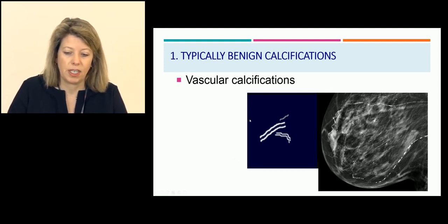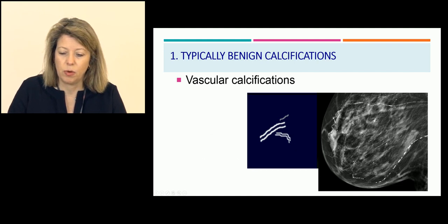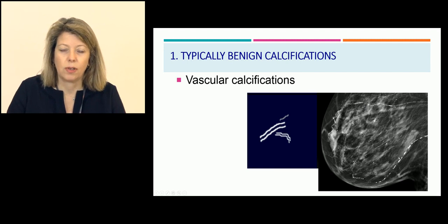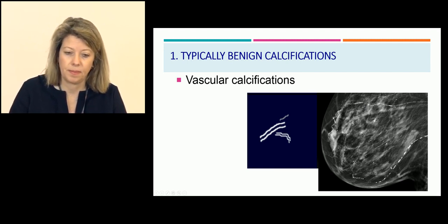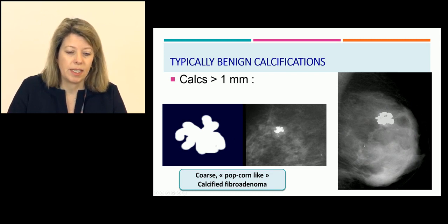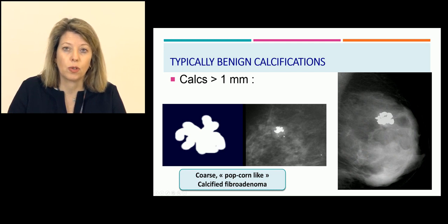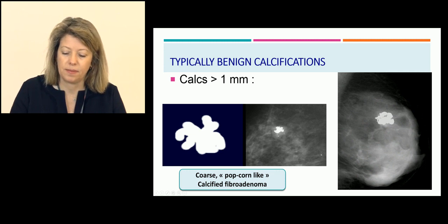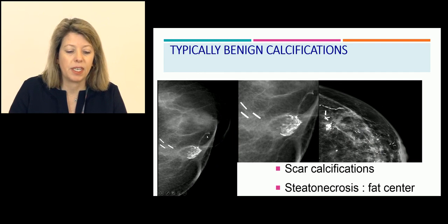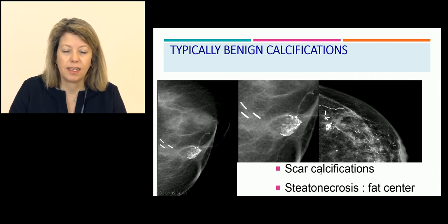These are vascular calcifications — as you can see in this mammography with typically benign vascular calcifications. These patients have diabetes and it could be a marker of arteriosclerosis. Another case of typically benign calcifications: when the size is larger than 1 mm, they are usually benign, as in these examples of coarse popcorn-like calcified fibroadenoma — typically benign.